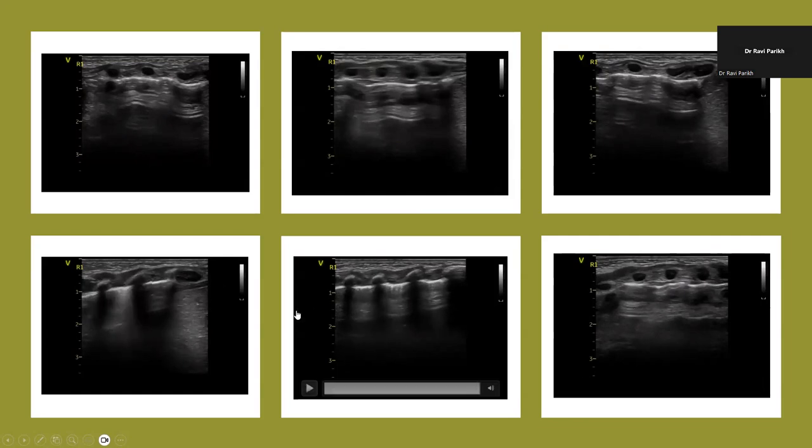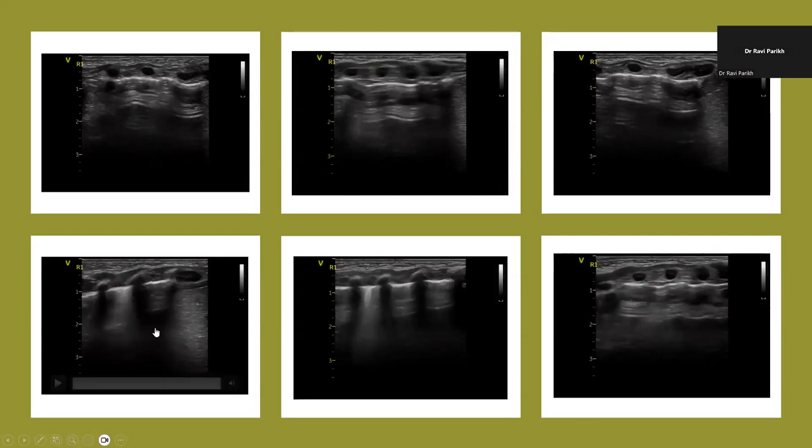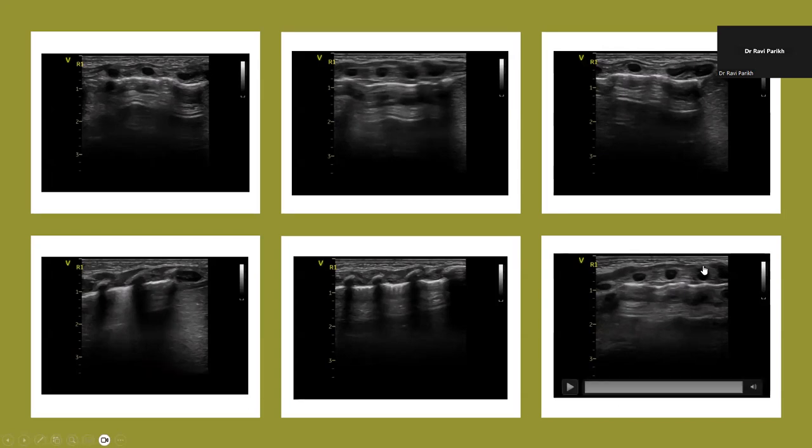Okay. And from my perspective, when we peer reviewed these images, everybody was very confused about whether there is a pneumothorax or not. Now, the risk with this kind of reporting and having images stored like this is if this baby goes on to develop a tension pneumothorax, I've labeled R3 as R1. I have reported, and I'll probably report, that I think there's a right anterior pneumothorax, but people would then question that. That is where I would say it's not good enough to just capture the images to make your clinical interpretation. You've got to label the images correctly as well.